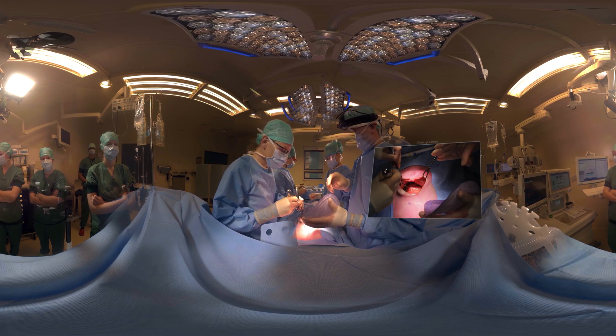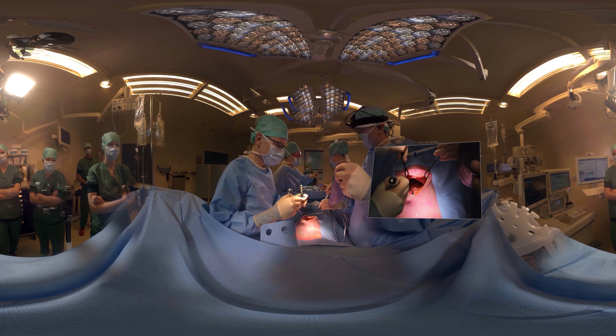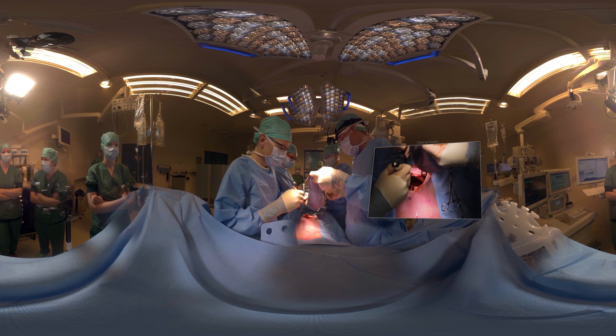Now we're going to position the mesh, preferably without touching the skin — it's not terrible if it does, but we try to avoid it.